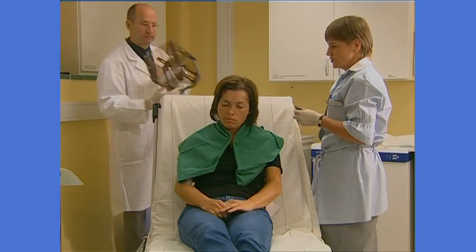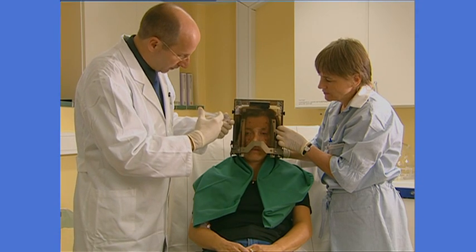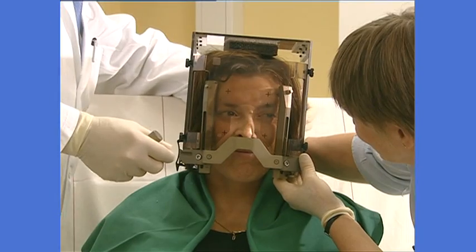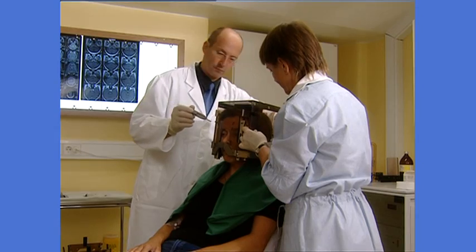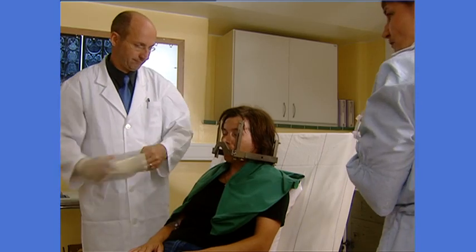Before treatment, the doctor will inform you about the whole procedure. To begin with, the lightweight frame will be placed on your head. Hair doesn't need to be cut or shaved. Local anesthetic is applied where the frame is to be attached. Once the anesthetic has taken effect, the frame will be fixed to the head with four pins. The frame remains on your head throughout the entire procedure, to keep the head in a stable position during imaging and treatment. Attaching the frame takes about 15 minutes.